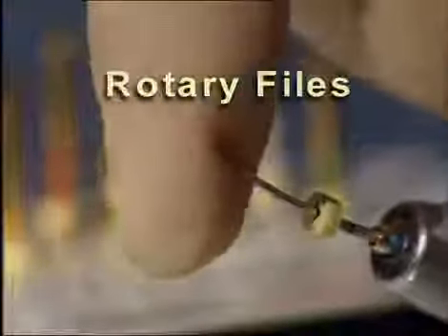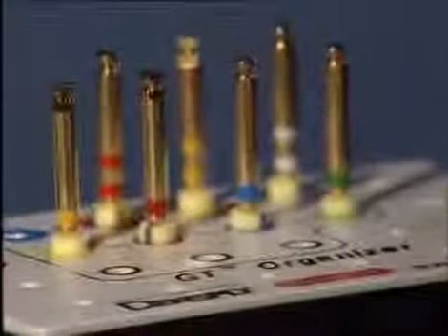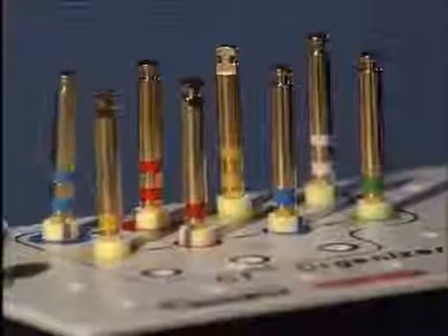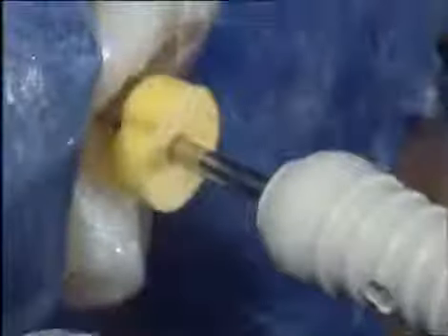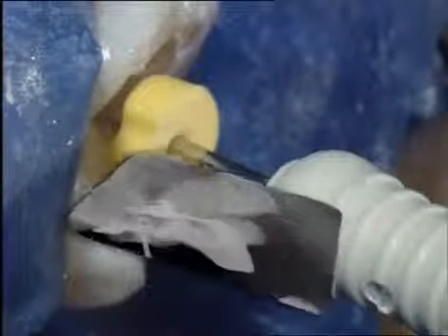Due to their super-elasticity, instruments made of nickel titanium allow even the less trained dentist to shape curved canals without apical blocking or tearing. Nickel titanium can be effectively used as a rotary root canal instrument in moderately curved root canals. Before using rotary nickel-titanium instruments, the path to the radiographic terminus should be established with the number 15 file during initial apical preparation. With this instrument, the initial length is controlled.